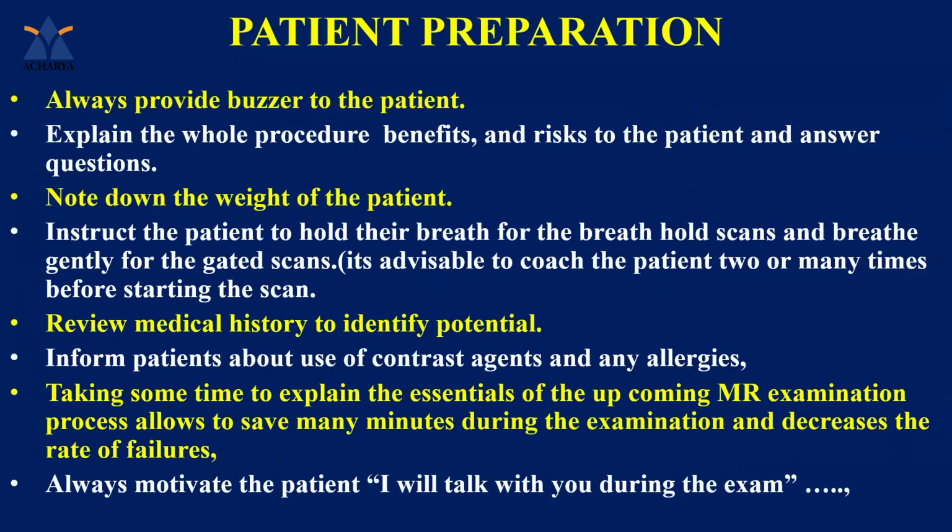Explain the whole procedure, benefits and risks to the patient and answer the questions. Note down the weight of the patient and instruct the patient to hold their breath for the breath-hold scans and breathe gently for gated scans. Review the medical history to identify potential problems. It's very, very important, because depending on the medical history we select the protocols. Inform the patients about the use of contrast agent and any allergies. Explaining the essentials of the upcoming MRI examination process can save many minutes during the examination and decrease the rate of failures. Always motivate the patient before doing the MRI scans.